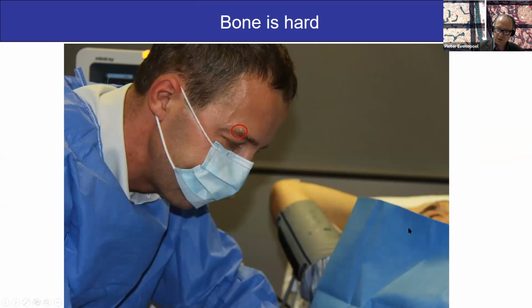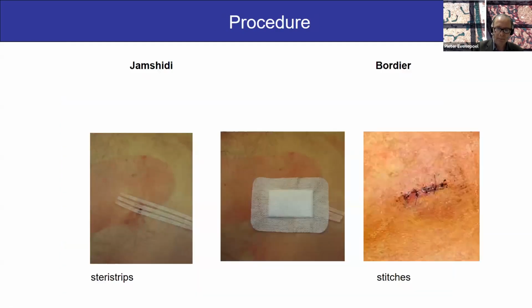At the same time, the patient is almost sleeping, so the discomfort for the patient is really minimal. This is one of the misconceptions we still have about bone biopsy. Everyone always starts laughing: bone biopsy, you cannot do it, it's too invasive. But at least with the smaller needles, with a nice preparation, anesthesia and some slight sedation, it's really something which is very well tolerated by patients.